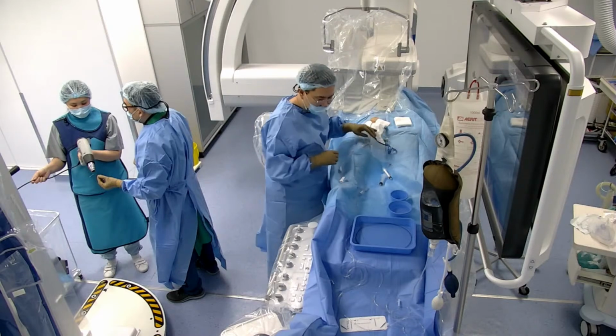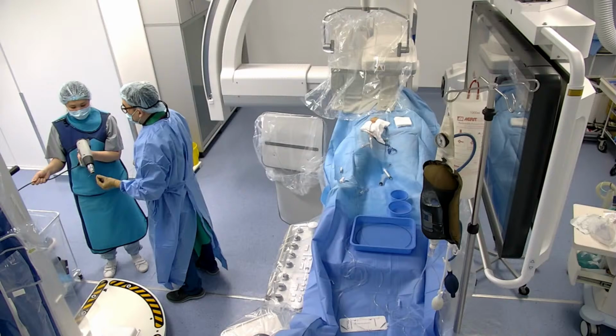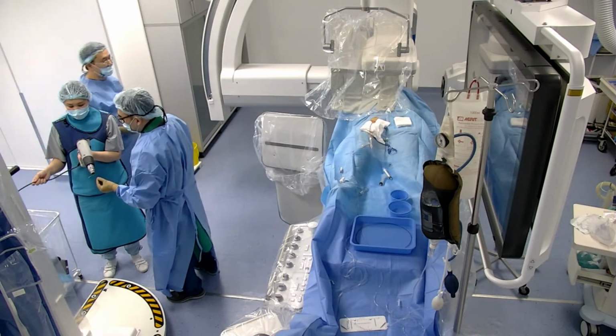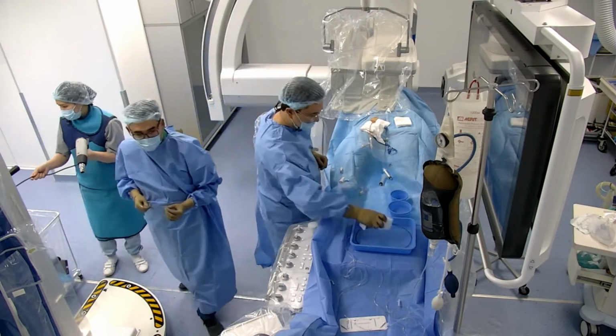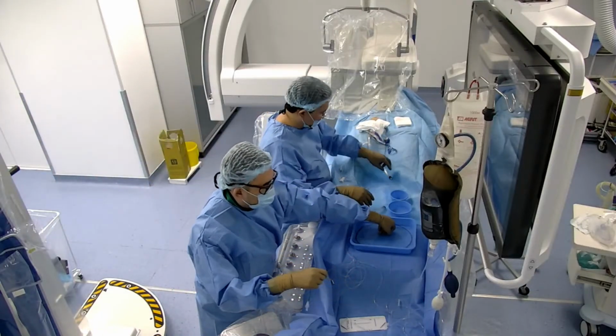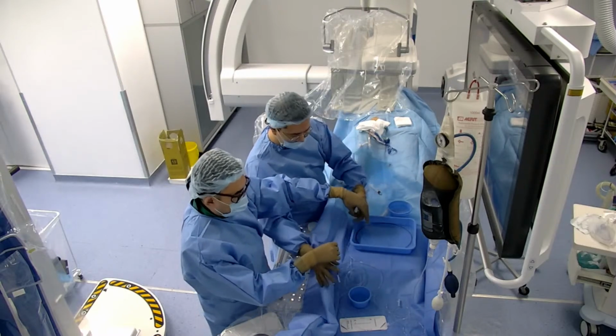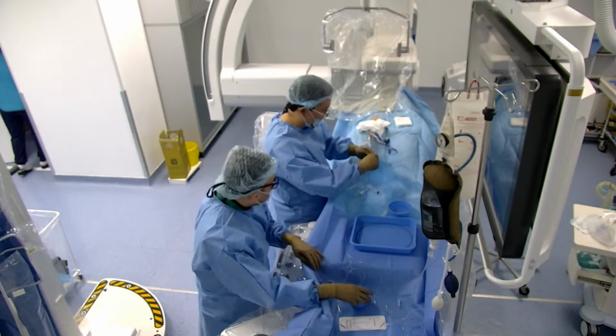Through the short sheath and Fubuki 100 cm. And the micro catheter will be contrast. Contrast. Yes. Micro catheter will be Headway.